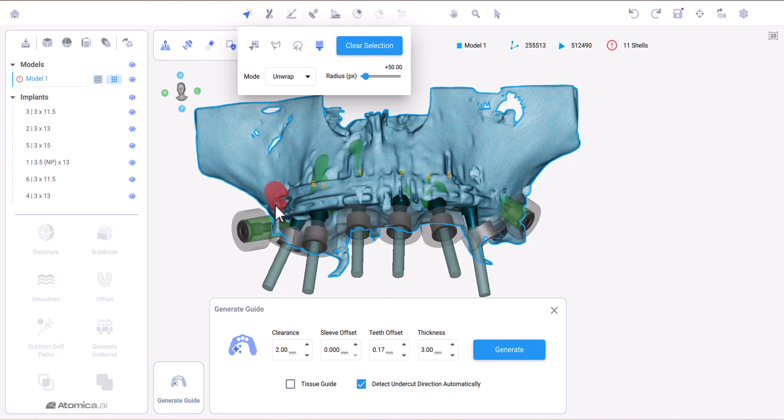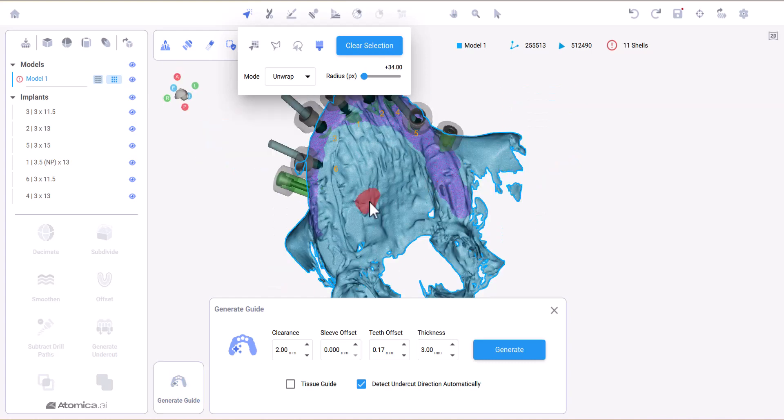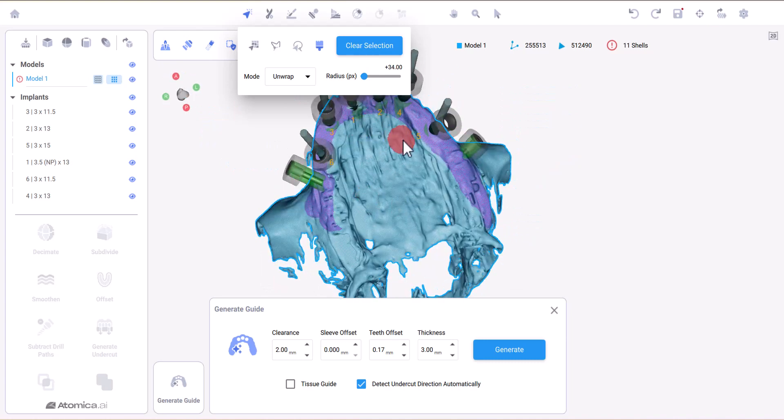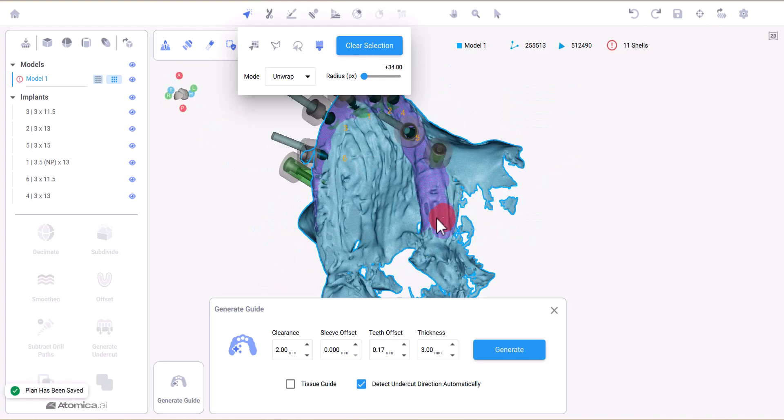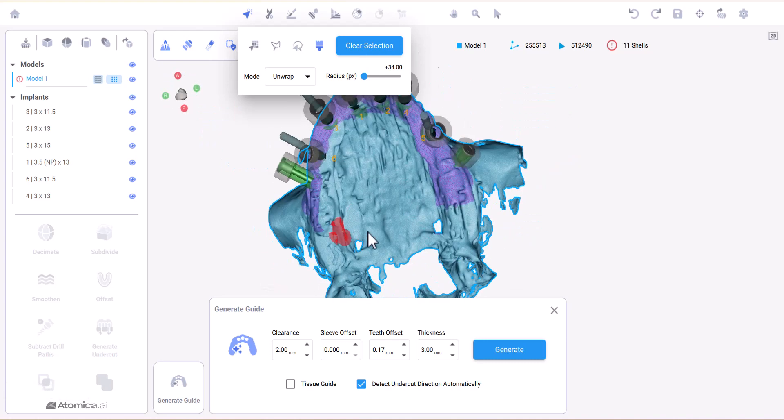As you can see here, the bone CT is converted into an STL model which you can mark the guide design on. Mark the desired area and click generate guide, and here we go.